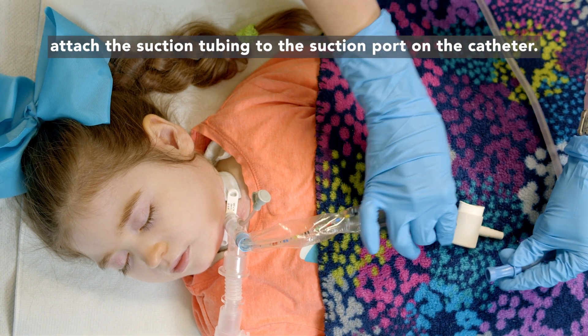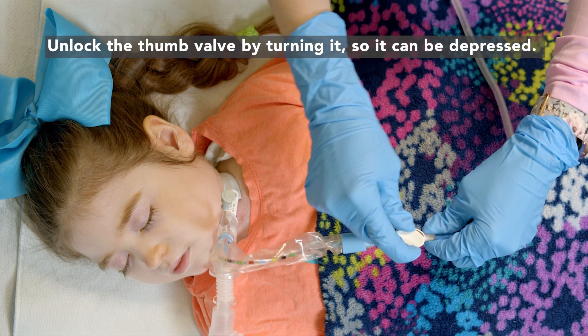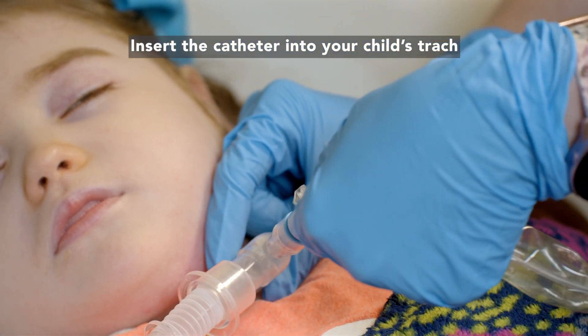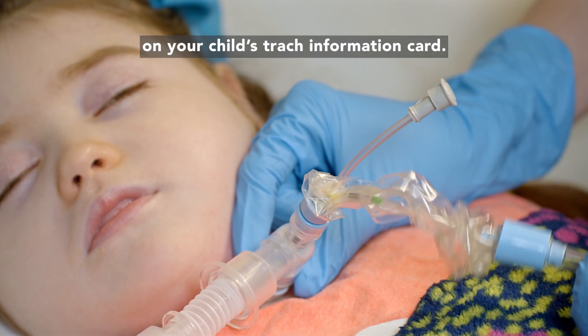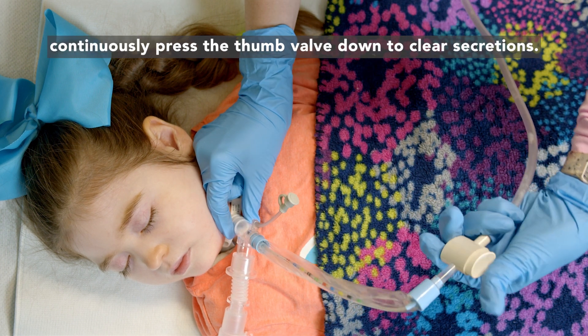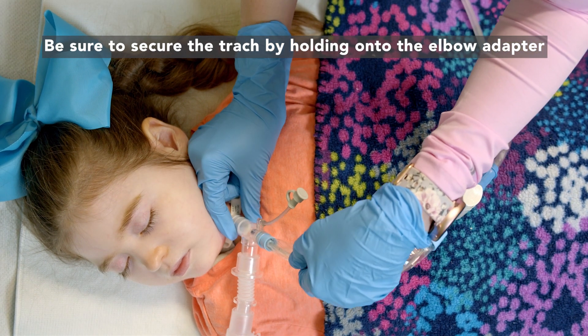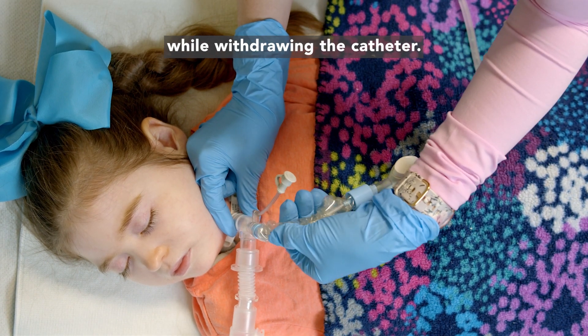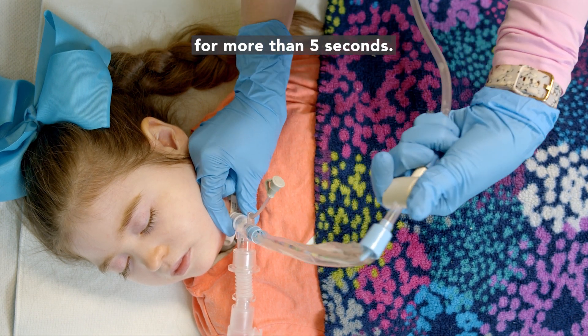To perform in-line suctioning, attach the suction tubing to the suction port on the catheter. Turn on the suction machine. Unlock the thumb valve by turning it so it can be depressed. Insert the catheter into your child's trach to the number specified on your child's trach information card. While slowly withdrawing the catheter, continuously press the thumb valve down to clear secretions. Be sure to secure the trach by holding on to the elbow adapter while withdrawing the catheter. Do not keep the suction catheter in the airway for more than five seconds.